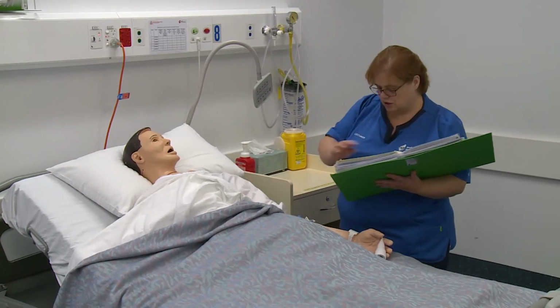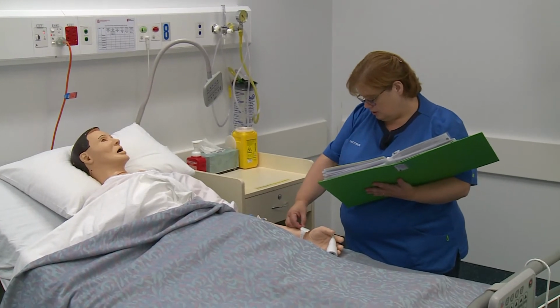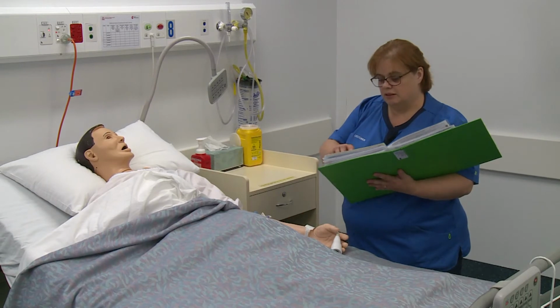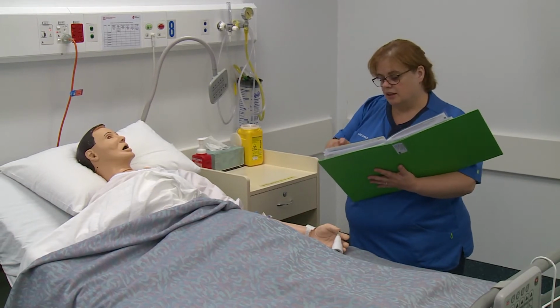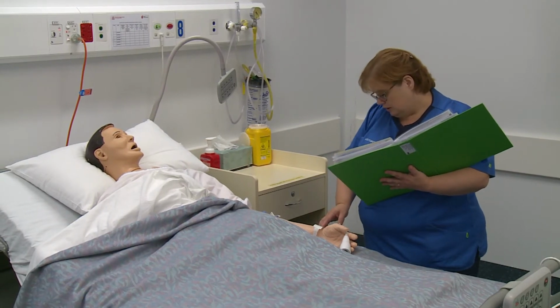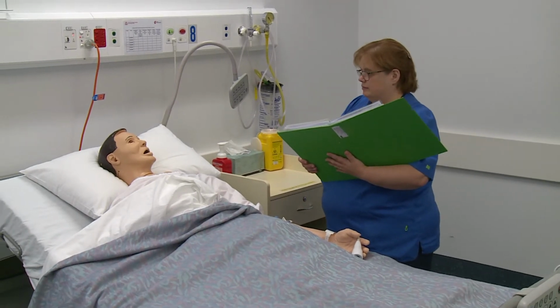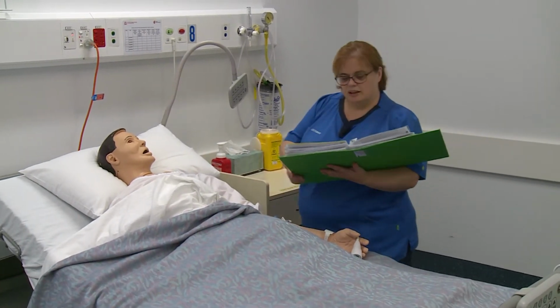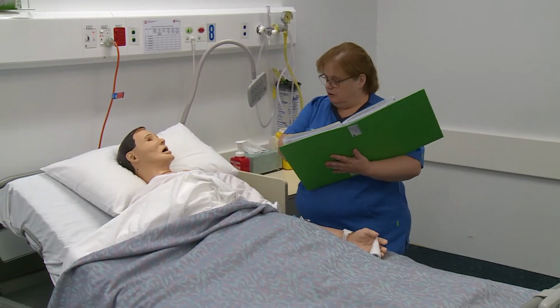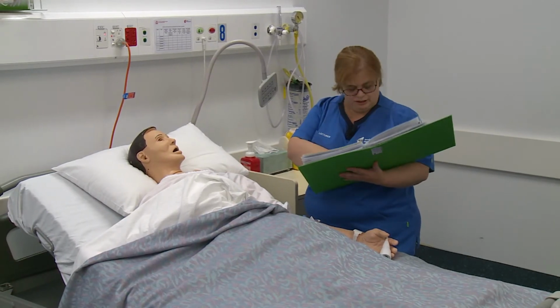Okay, so firstly I'm going to check your name band, make sure we have the right patient. So it's Thomas Hoggs, and URN is 834567, and your date of birth is 16/1/1954. Can you confirm that for me? Okay, that's brilliant. Are you allergic to anything that you know of? No. Okay, so that's right. That matches what we've got here, that there's no known allergies.